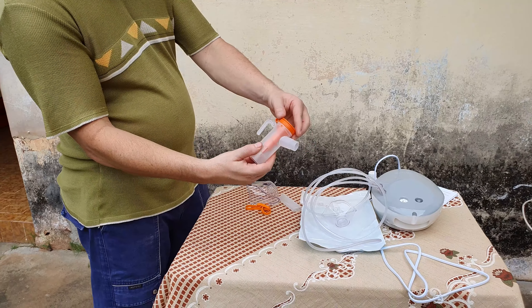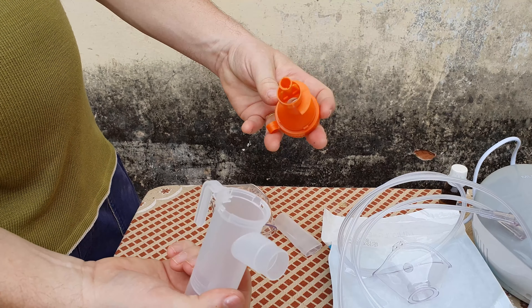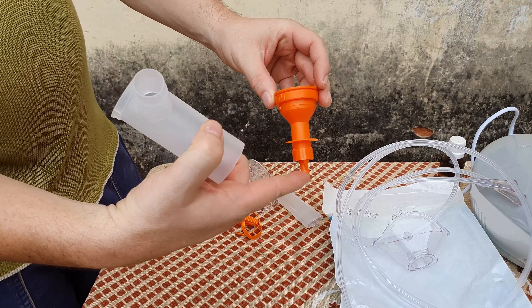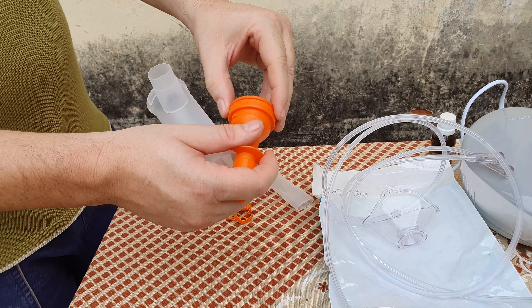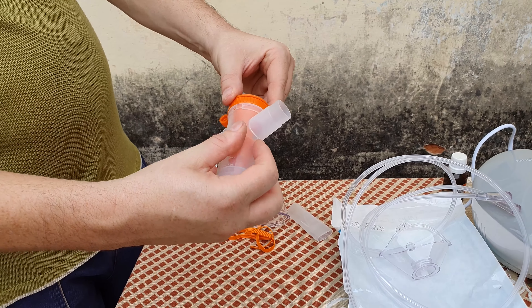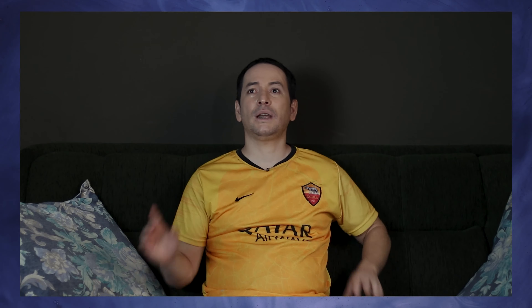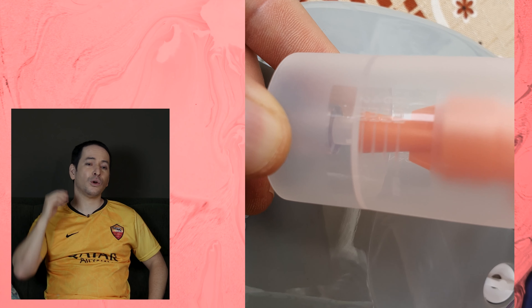O container para colocar o medicamento é muito legal porque é fácil de abrir. Tem uma parte de plástico durável — claro, você tem que ter cuidado para não quebrar, mas é bem durável. Ele tem algumas posições que você pode mexer para aumentar ou diminuir a vazão da oxigenação na máscara. Um detalhe que a Multilaser pensou foi ter o marcador de medicamento. Esse marcador é muito importante porque às vezes a pessoa precisa medir a dosagem que está utilizando, e esse marcador faz toda a diferença no processo.